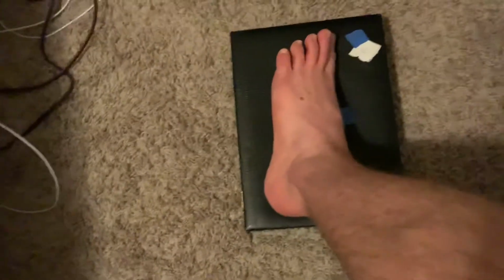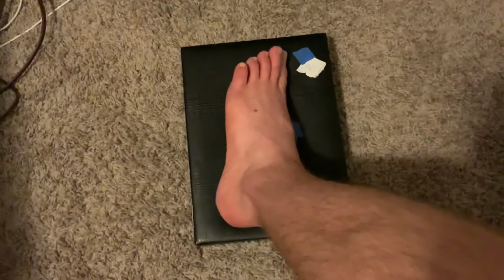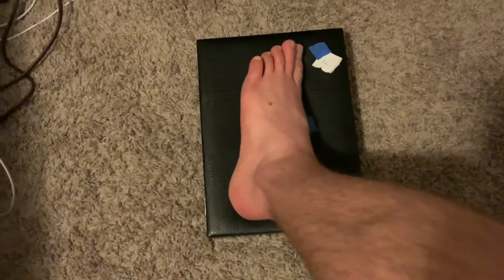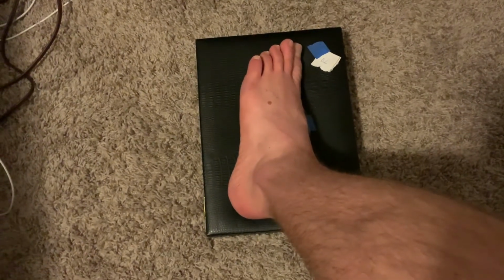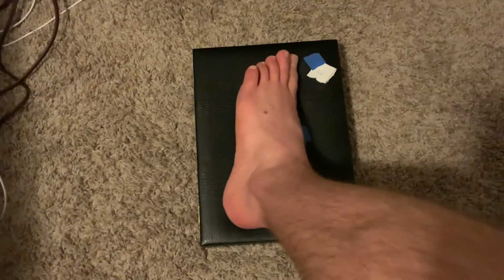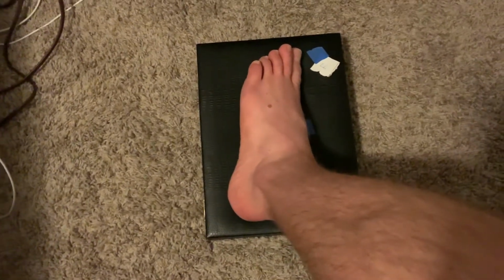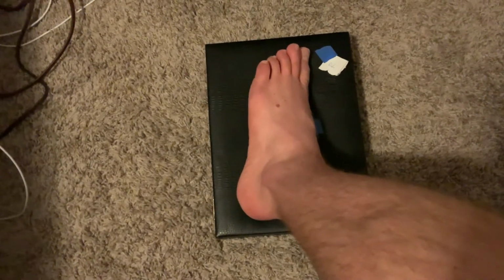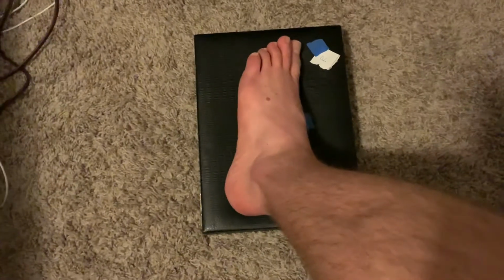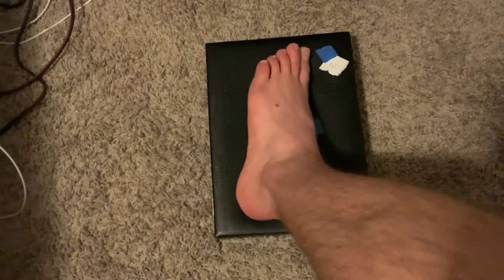The medial oblique foot, just like the medial oblique toes, will be medially rotating the foot and leg about 45 degrees. Our central ray will again be directed through the midpoint of the foot at the base of the metatarsals, and our collimation will include the phalanges, the metatarsals, the cuneiforms, the cuboid, and the navicular, and this will also give us a clear view of the lateral articulations of the foot.